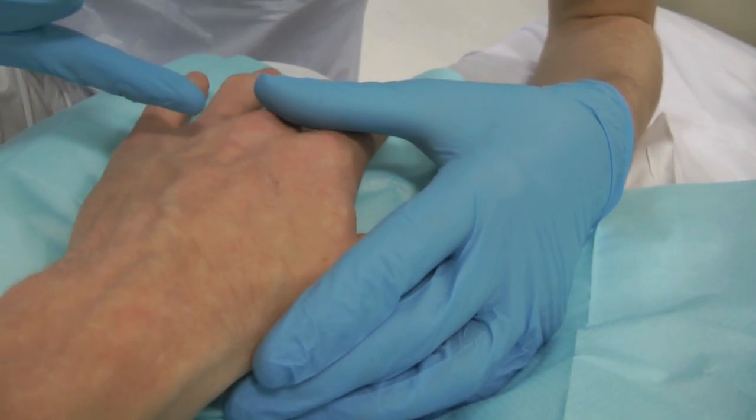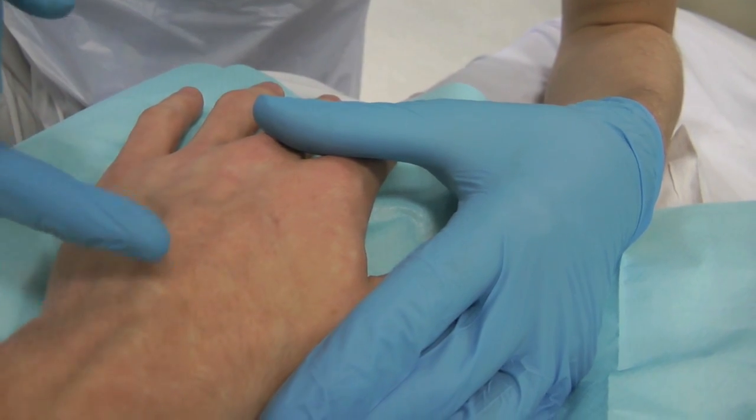Here we demonstrate how stretching the skin and anchoring the vein straightens it to allow for an easier cannulation.